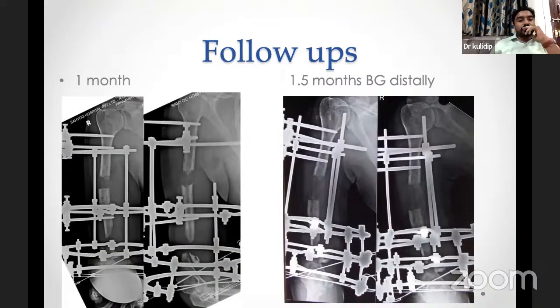And that's how it was done. I did a shaft corticotomy rather than a metaphyseal epiphyseal corticotomy, but still it went with a good regenerate. I had used 3 wires in the last 2 ring block for the distal humerus.